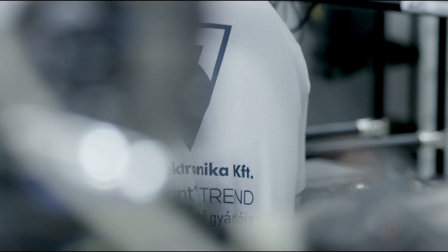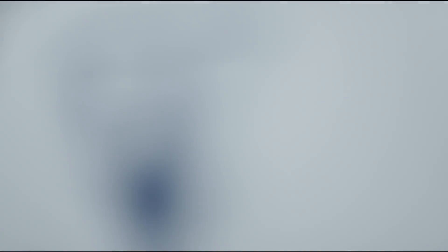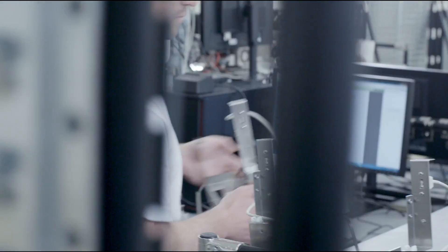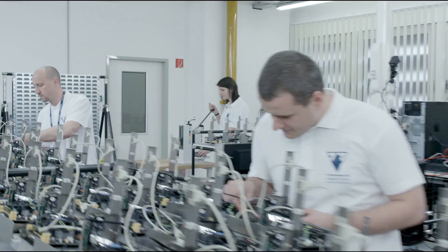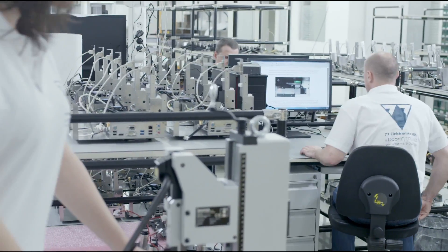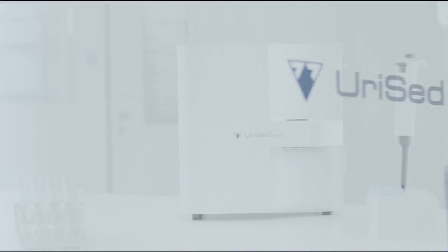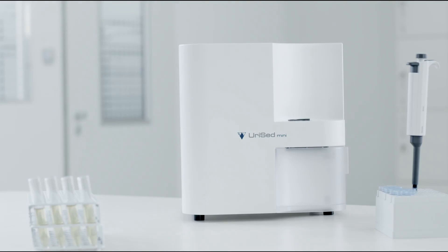URISED Mini is based on the patented URISED technology, which includes the measurement sequence, the cuvette as a consumable, and the auto-image evaluation module, just like in case of URISED.